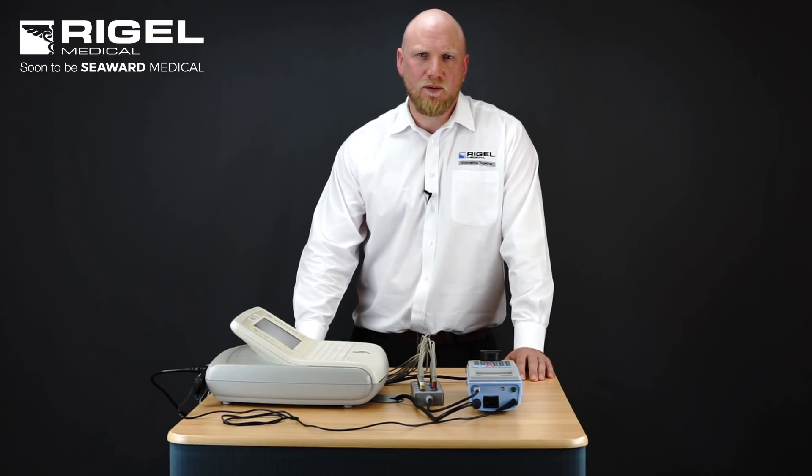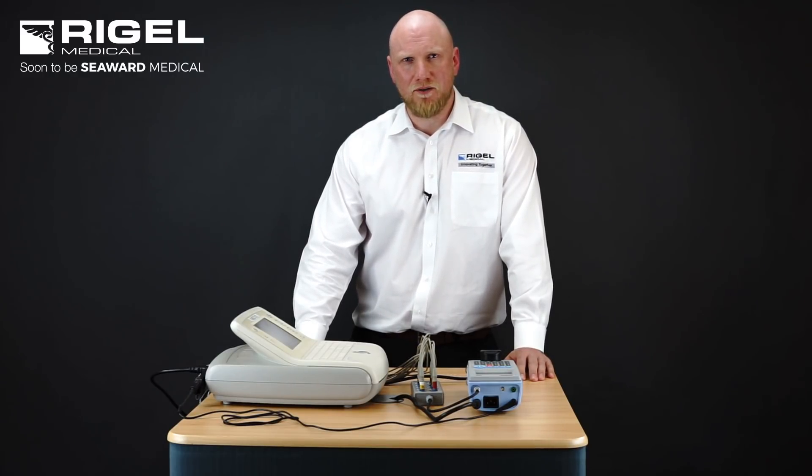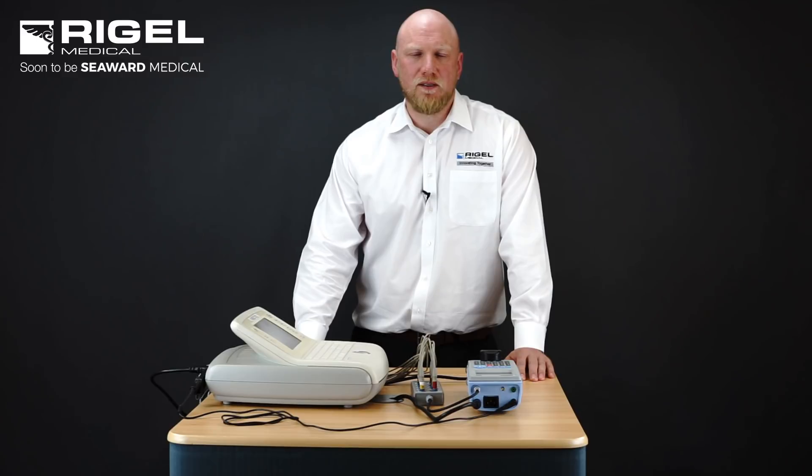The tests available are earth bond and insulation. Insulation is not generally a mandatory test. Specific to IEC 60601 we have earth leakage, enclosure leakage, patient leakage, patient auxiliary leakage and F-type leakage.